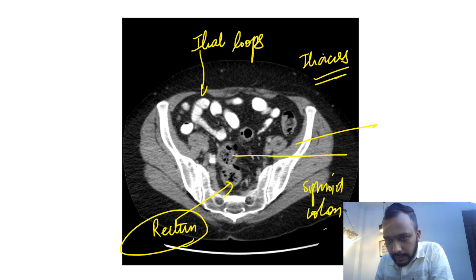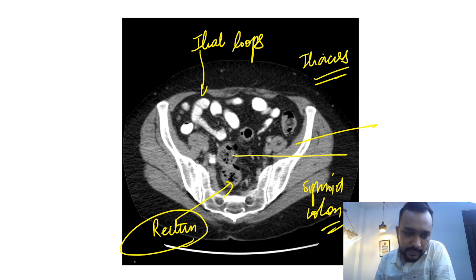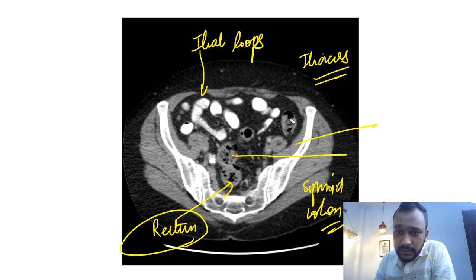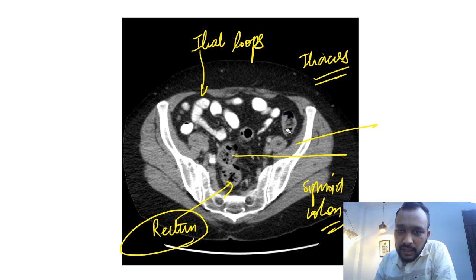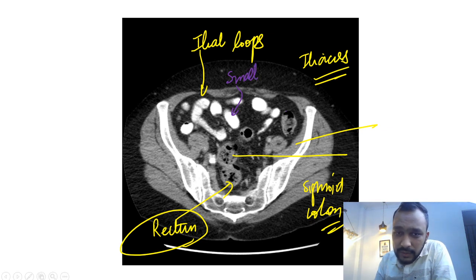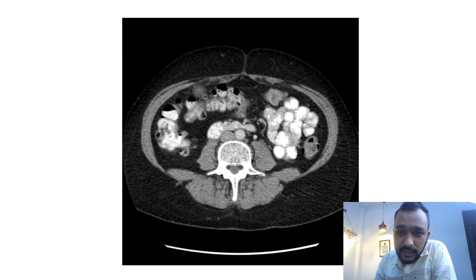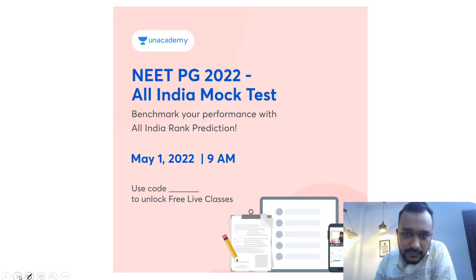Just remember: in the sigmoid colon and rectum, air is present. In large bowel loops, air is mixed with the contents. But if you look at the small bowel loops, they have liquid contents, and even if air is visible, it will not be mixed with the contents.